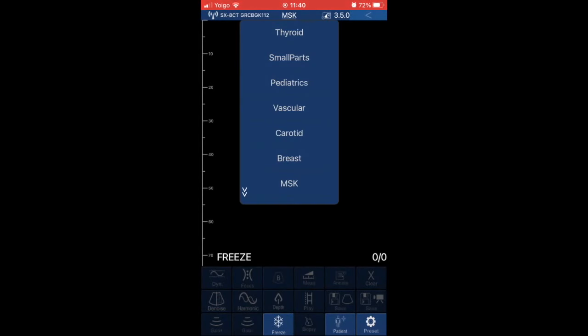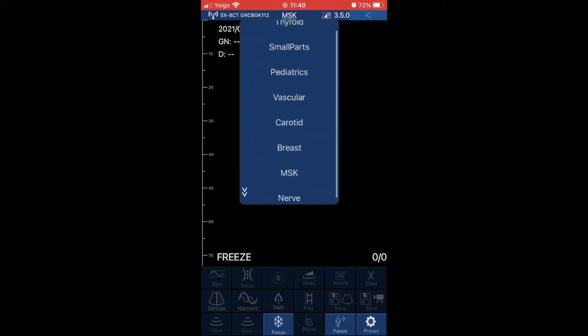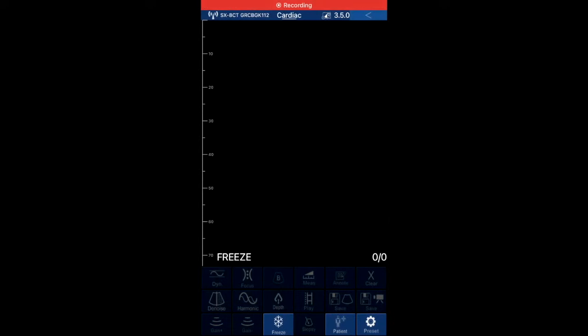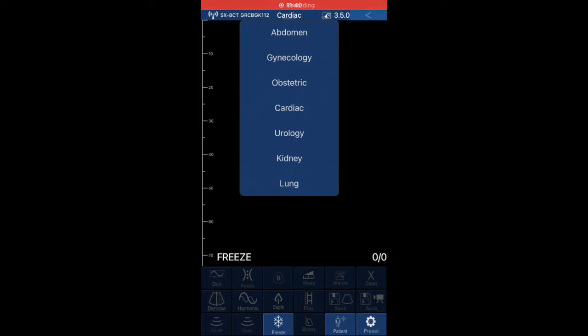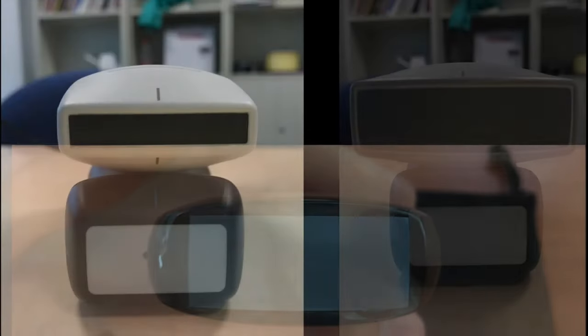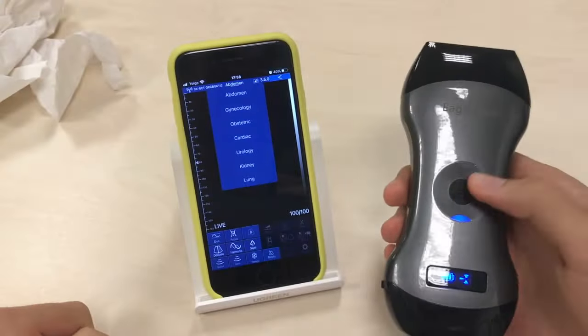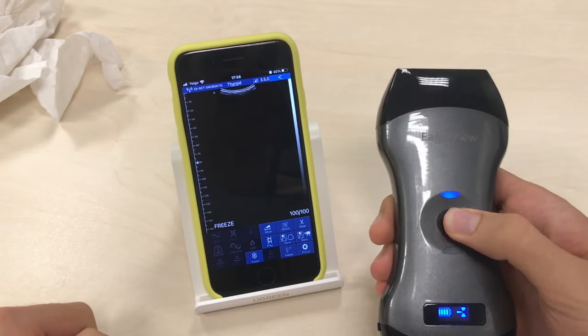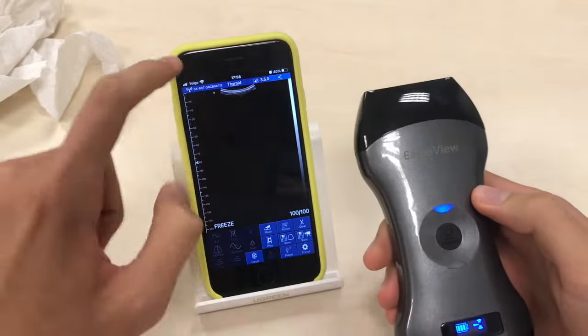It has two probes integrated in the same device. The linear end is tailored towards shallow exams such as musculoskeletal, vascular, thyroid, lung, breast, nerves, sports medicine, and interventions in general. The curved end is for deeper exams such as cardiac, abdomen, OB-GYN, and urology. The footprints are the usual ones for linear and curved probes, same as Viscan but contrary to Butterfly. The single button switches the device on/off, freezes the image, and changes between both probes, with a light indicating which one is active.